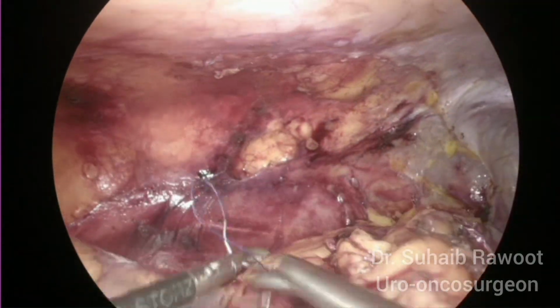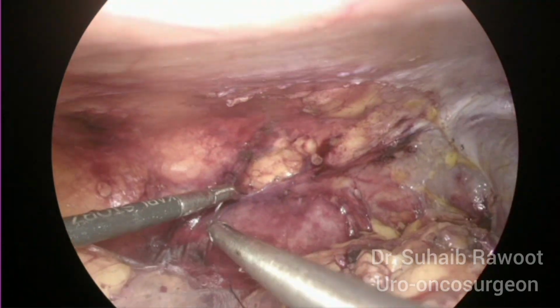In the end, we take a few tucking sutures of the Gerota's to the lateral pelvic wall.